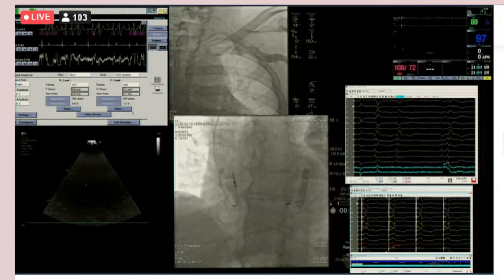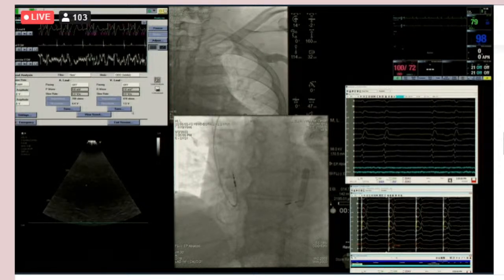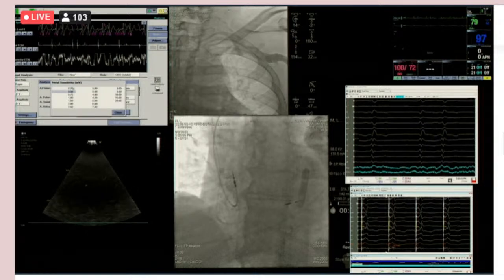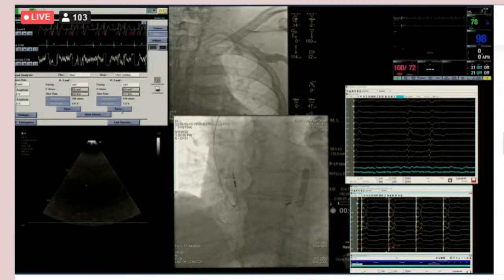Yeah, before this came around, I have to say, if I had a little old lady and I did want to put a lead in, often I would just put a Tendril lead in, because those really don't perforate. And if they're 85 years old, the likelihood you have to pull out that lead is pretty low. As a person who does extractions, one of the things that does worry me a little bit is how much tissue is going to come out when you pull that out if you have to. But I think we're going to learn. I think that's the beauty of it.